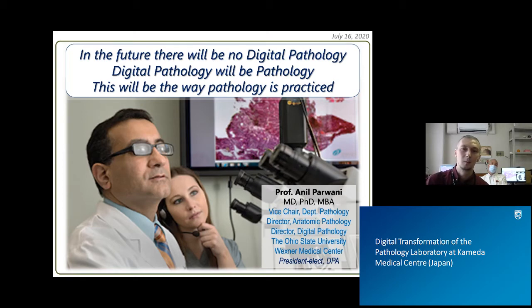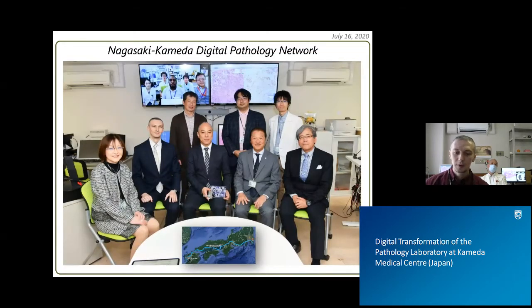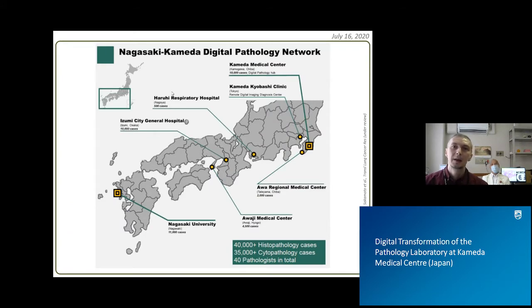And I'm going to explain why. So let me share with you our digital pathology journey. We aimed initially to build a model digital pathology network in a multi-hospital environment. And our priorities were initially on clinical applications of digital pathology, particularly making primary diagnosis, which means sign-out without any glass slides or microscope. The Nagasaki Kameda Digital Pathology Network was fully established in 2017.